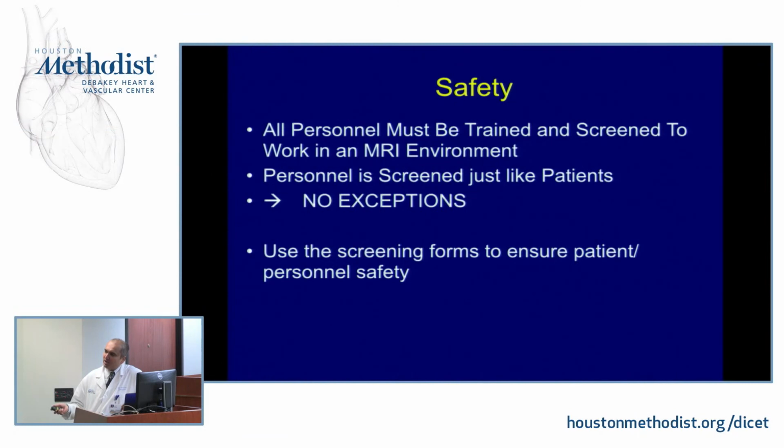The other thing is that before any patient goes into the room, we have a careful screening form that we do to ensure that the patient doesn't have anything that's MRI unsafe. Because if they do, then we don't want to scan that person. Now the first step is knowing what they have. It doesn't mean every single thing is contraindicated. Even pacemakers and defibrillators now, we've got ways that we can do those, but we again have to make sure we know about it, and then we have to reprogram the device accordingly.